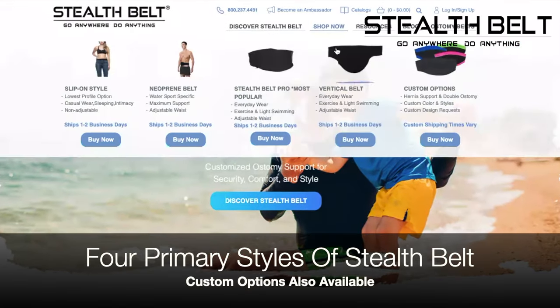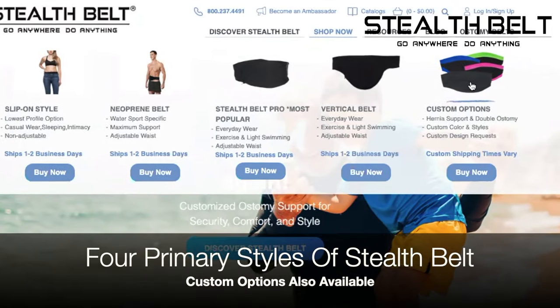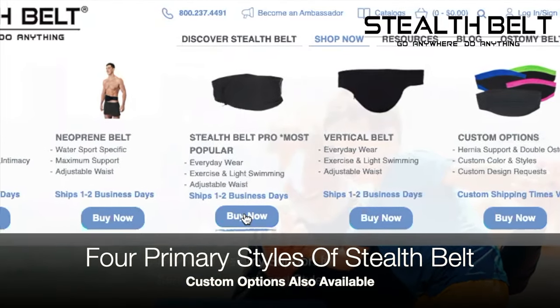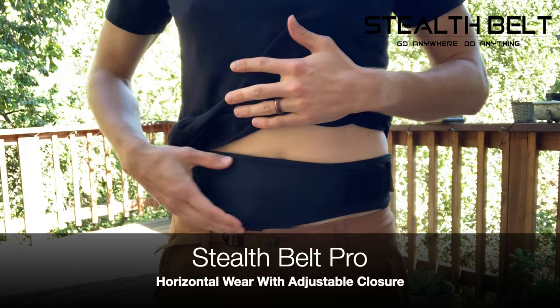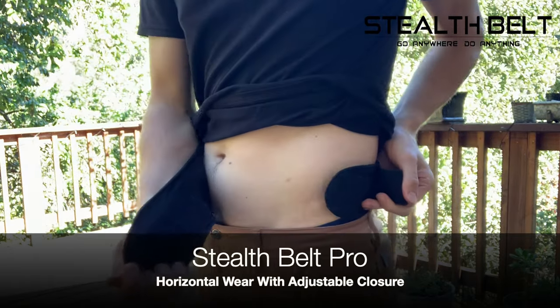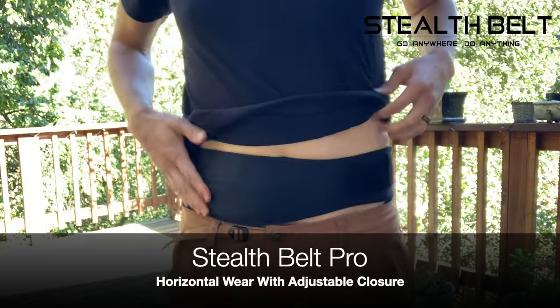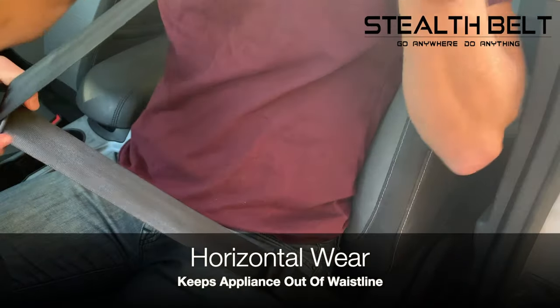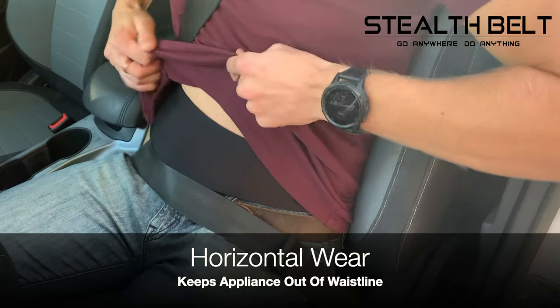There are four primary styles of Stealth Belt to choose from, along with a range of custom options and capabilities. The most popular style is the Stealth Belt Pro, which features a horizontally worn appliance and an adjustable closure. The horizontal wear is often preferred because it can help to keep the appliance out of the waistline and out of the way of things like seat belts and belt buckles.